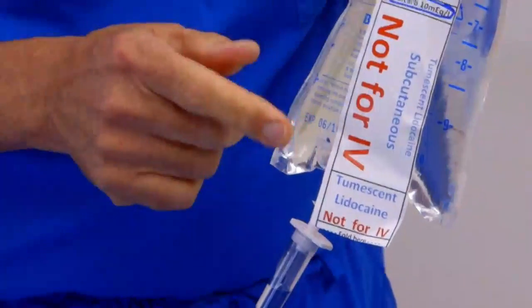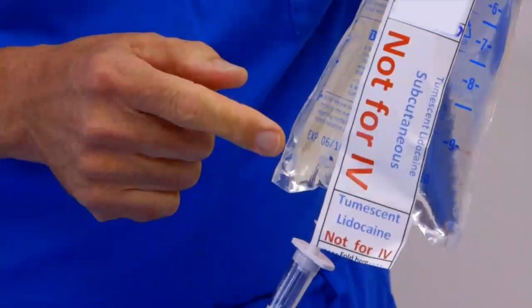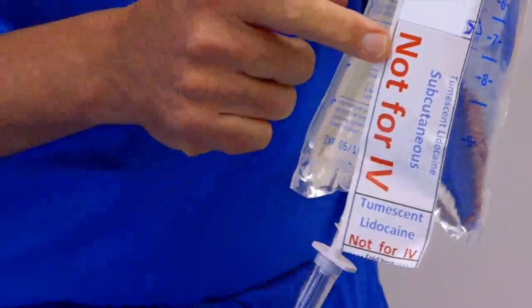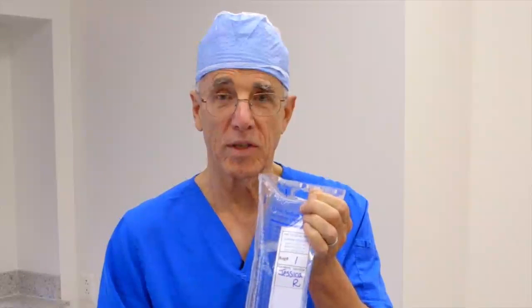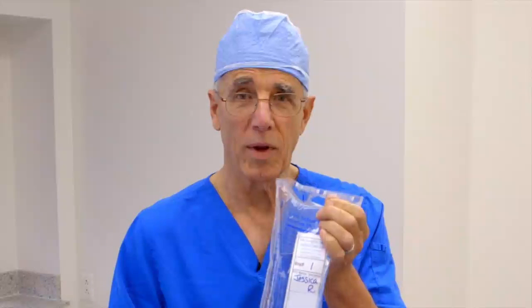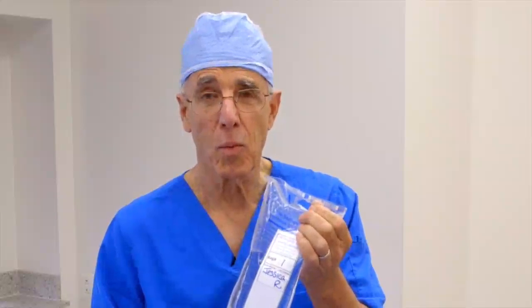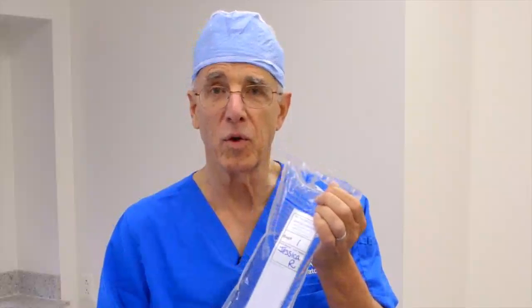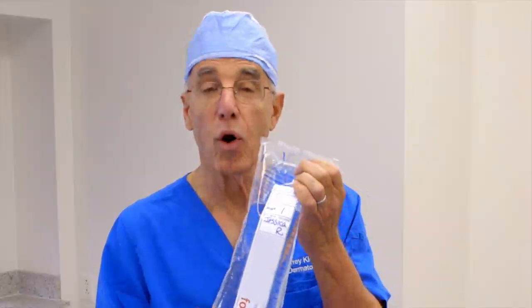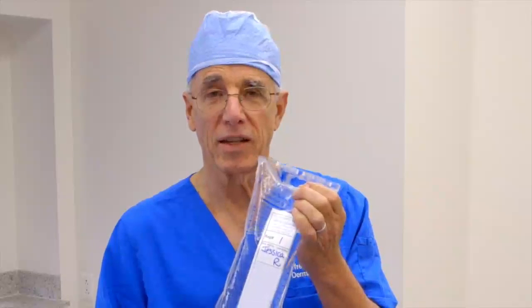You'll notice an important feature of this bag of saline is that it is labeled with a safety label that says very explicitly that this is not for IV delivery. There is a risk that someone might inadvertently hang a bag of tumescent lidocaine anesthesia or tumescent antibiotic solution and deliver it by IV infusion with potentially disastrous consequences. So it's important that a safety label always be placed on any bag of tumescent lidocaine anesthesia.